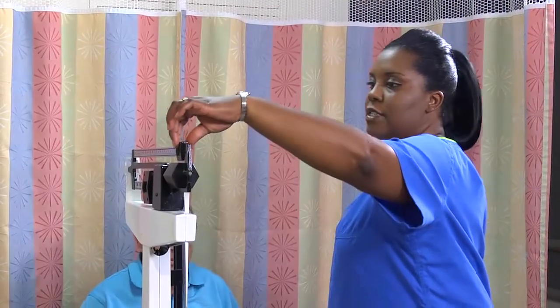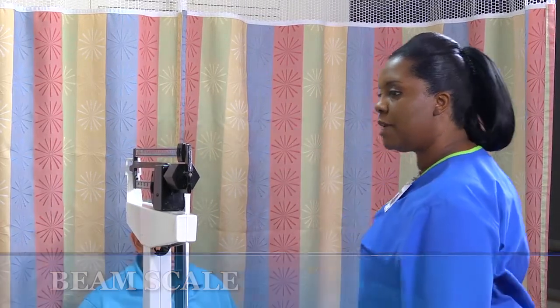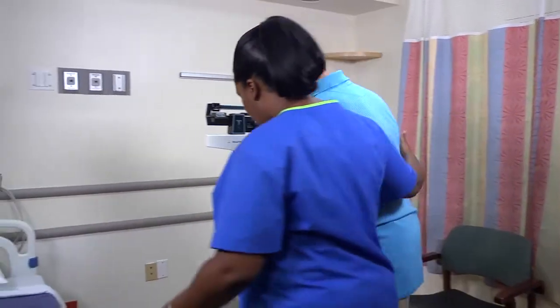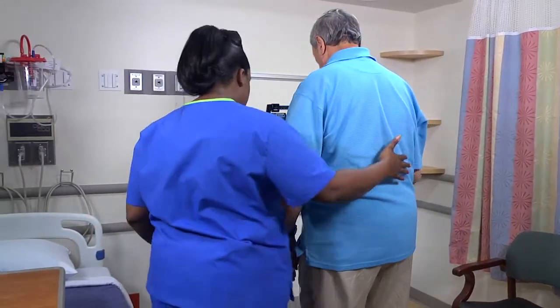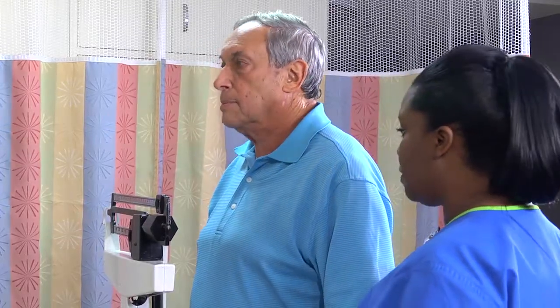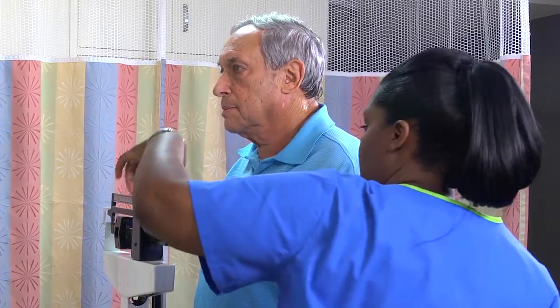For an accurate measurement, make sure the beam scale has been calibrated. Before you begin, slide each weight over to zero. Assist the patient up onto the platform. Ask him to stay still and distribute his weight evenly on both feet. Adjust the scale weights until the balance indicator rests in the middle. Record the patient's weight to the nearest tenth of a kilogram or about a fourth of a pound.